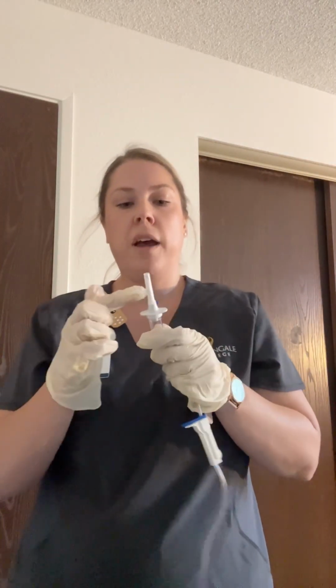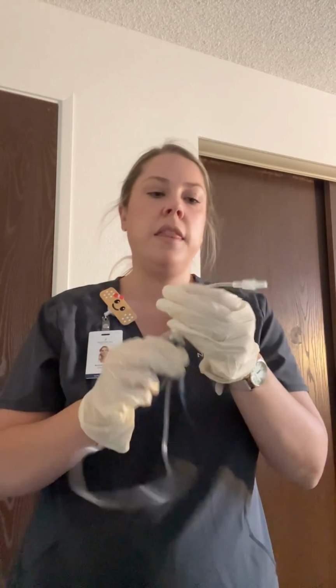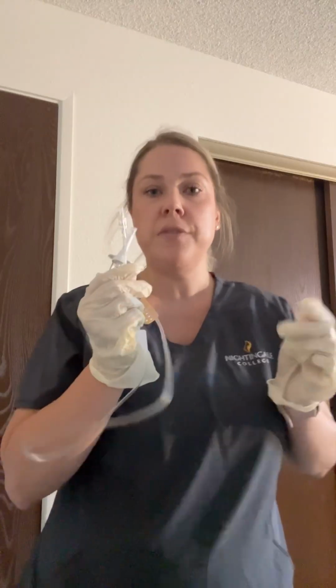Again, same thing with the secondary tubing. We have the spike, keeping the cap on to keep it sterile until we're ready. The drip chamber. The roller clamp, keeping it closed again until we're ready. And the adapter. The only thing different with this adapter from the primary is that this is actually going to go into the Y port of our primary fluid.